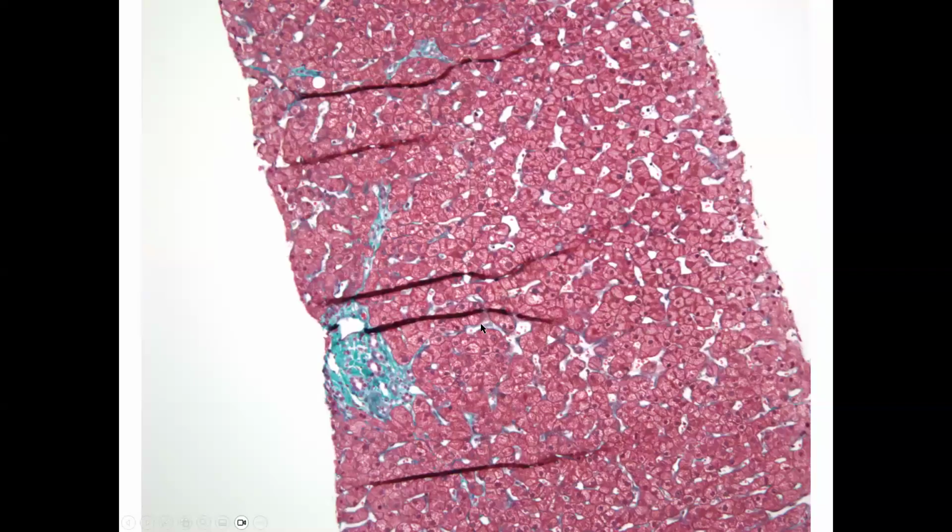This is the trichrome stain that we use to identify fibrosis and scarring in the liver. It stains collagen a bluish-greenish color. There's just enough connective tissue to hold together these portal tract structures. It's not expanded, and you don't see any branches of the collagen here. So normal liver does have collagen, but just enough to hold the portal tract together.